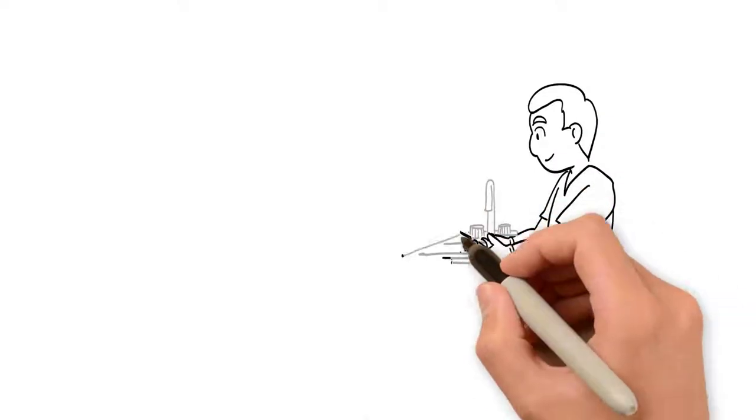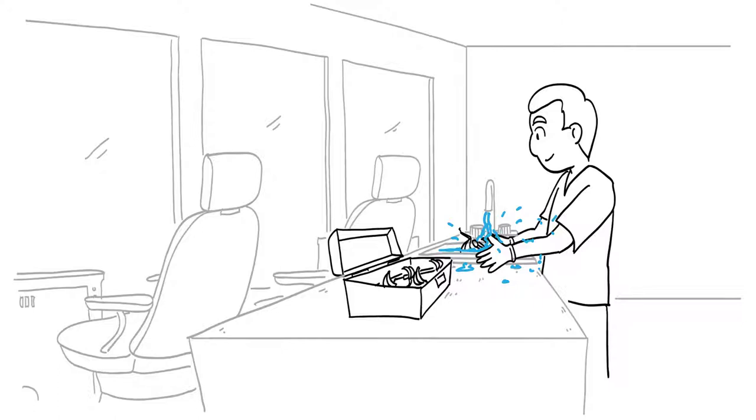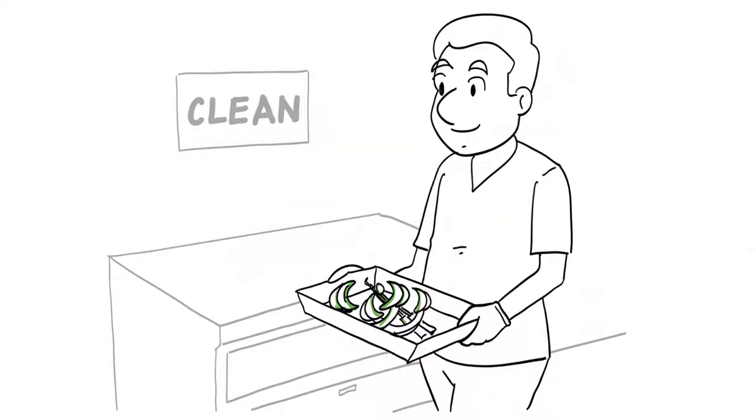All plastic instruments can be heat sterilized under 250 degrees or thrown away if disposable. Stop using cold sterile. You don't need it to clean plastics anymore.